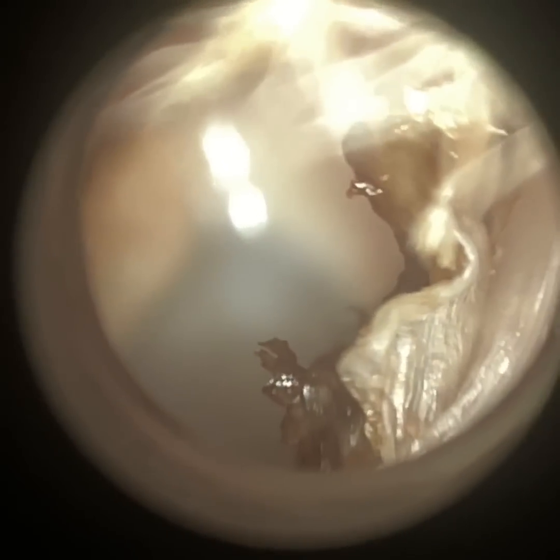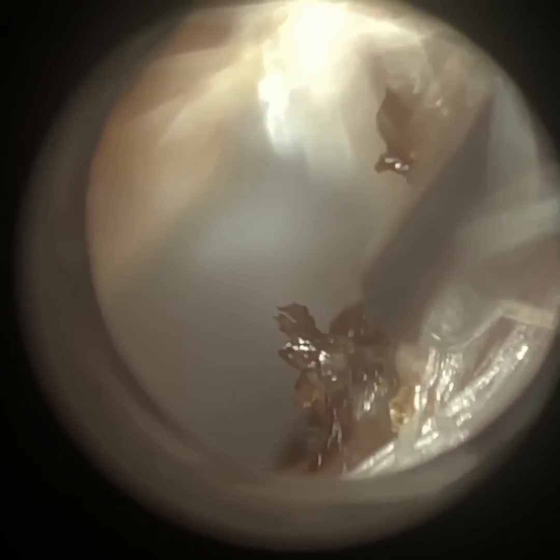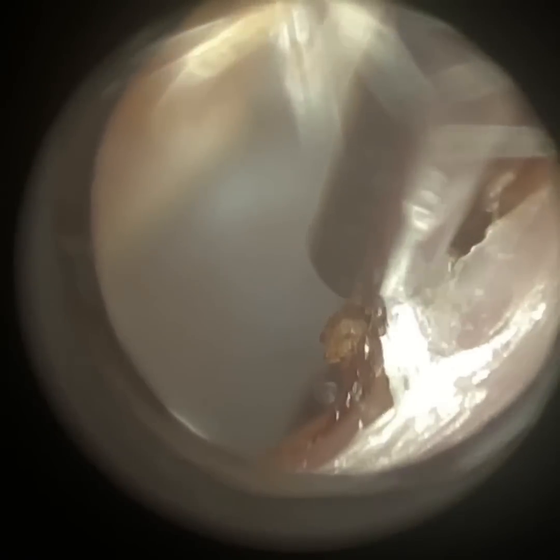So I'm just focusing on the anterior canal wall. I just reduced the brightness there for a moment, just because we are getting a bit of reflection because of the skin. I've just reduced the fine end size even further. And this just provides me with a bit more precision, especially when I'm working close to the canal wall.